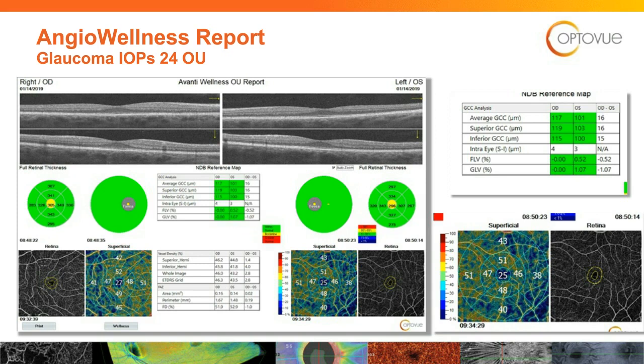47, 52, 49, 45. Down there around that 45. Look how nice, and a little bit of blue on the temporal area, which is expected. Nice and yellow and red down there inferiorly. If you jump over to the left eye now, 43, 51, 48, and then 40.